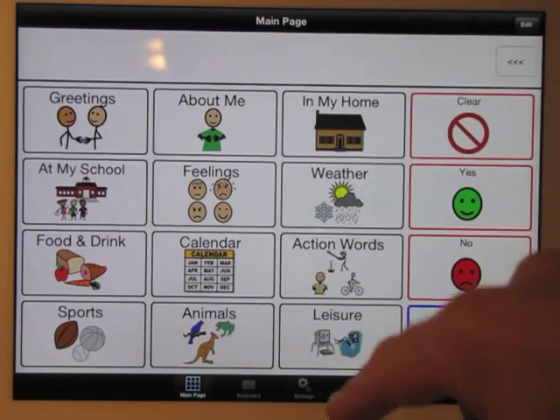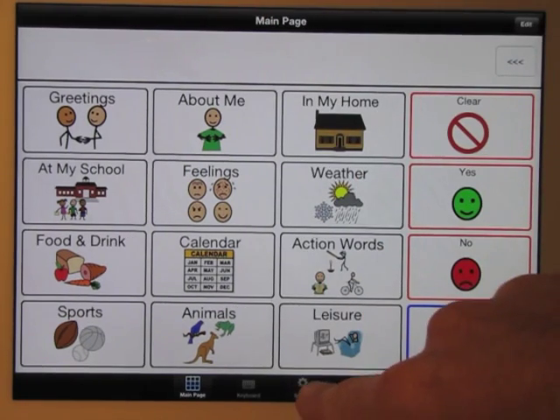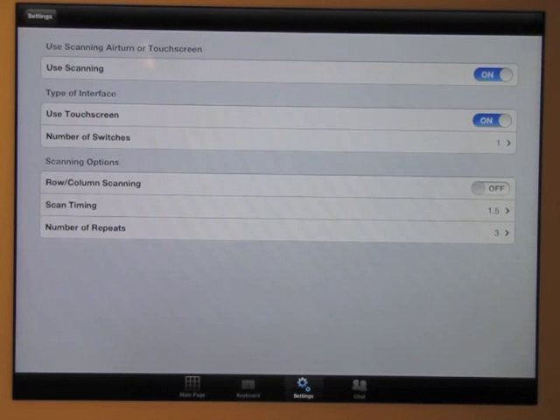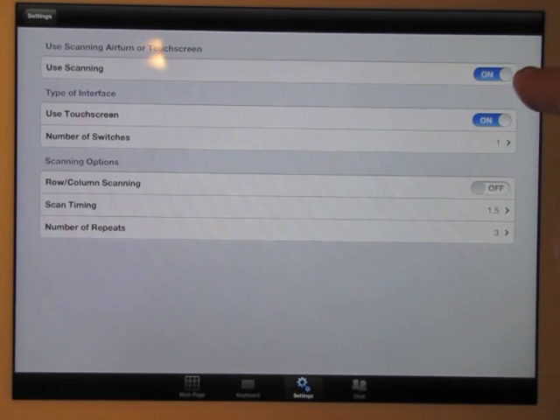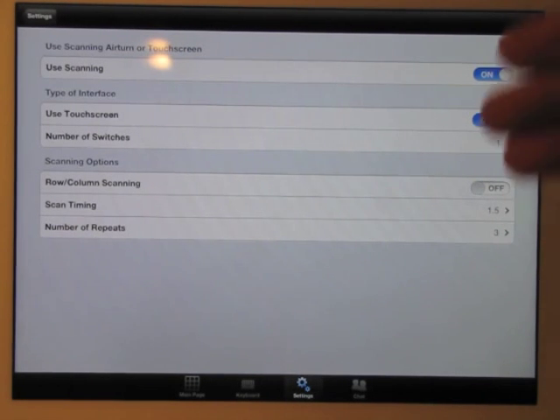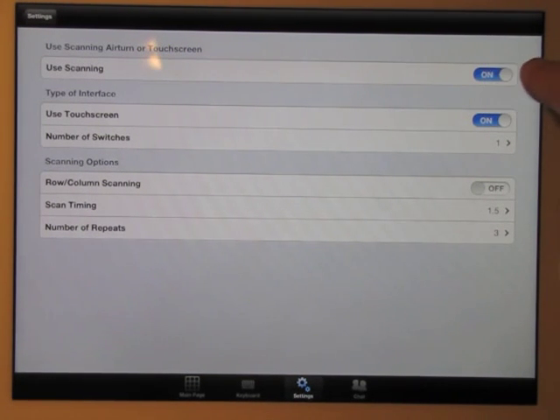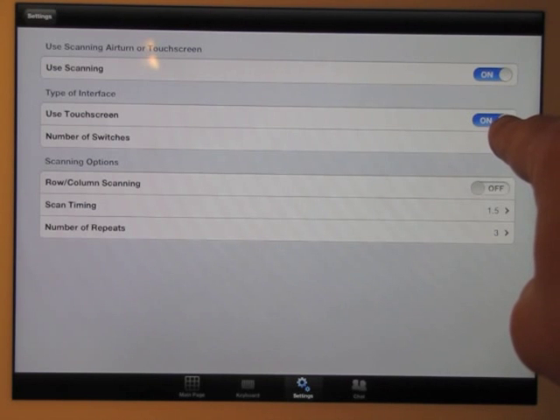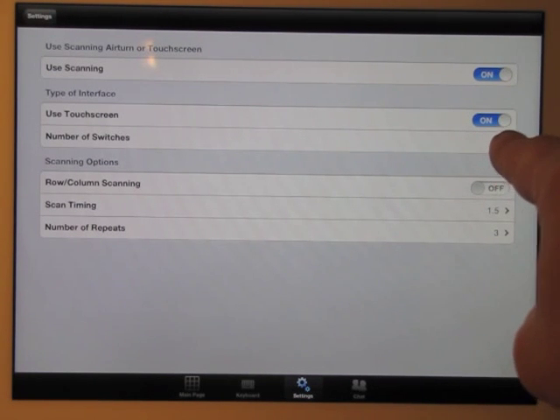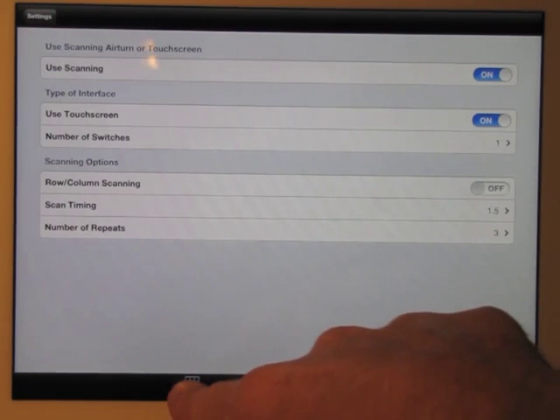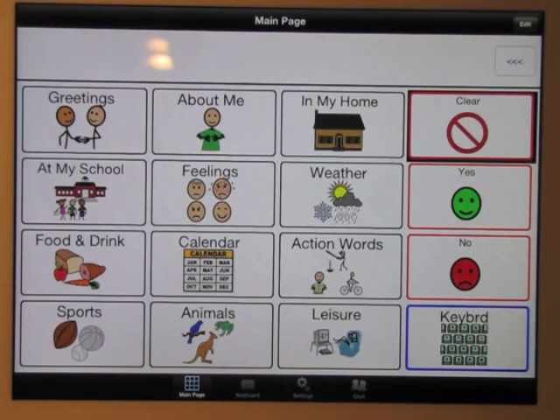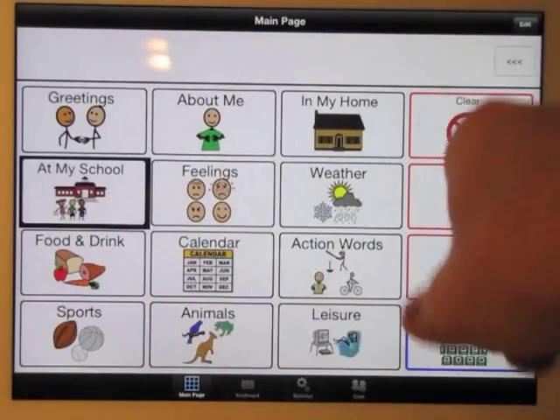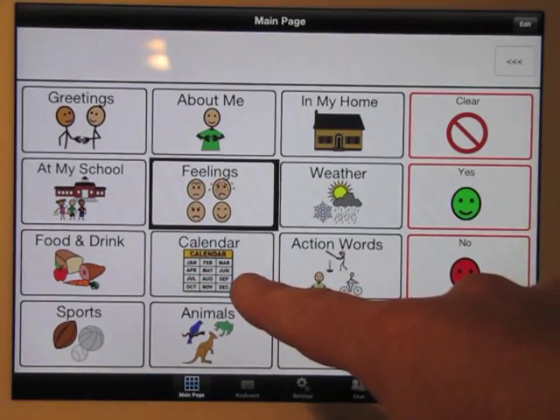To start scanning, I go into settings and I can turn on scanning. I'm going to give you an example of single switch scanning, both as step scanning and as row column scanning. We'll start simple — just turned it on, we're going to use the touchscreen as my switch, number of switches is one. I go back to my main page and there we have it, going from one button to the next.